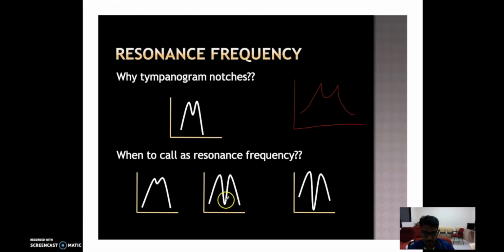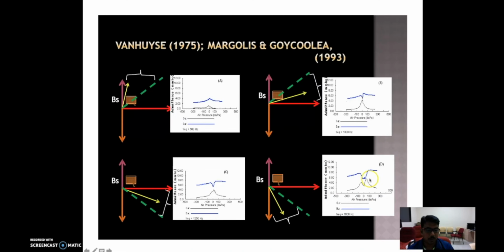In this case, it is close to zero, where the contribution by B is almost nil, because the amplitude at the notch is equal to the tail values. That means almost no compliance. So in this case, it is flowing in the negative direction. That means the total impedance is very close to the mass axis. So that is about notches, and that is about patterns.